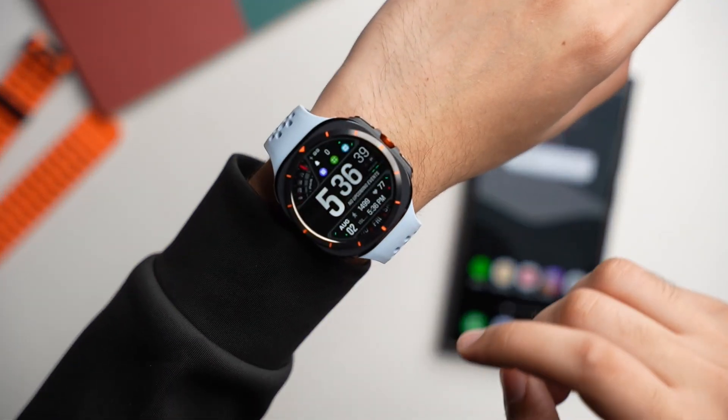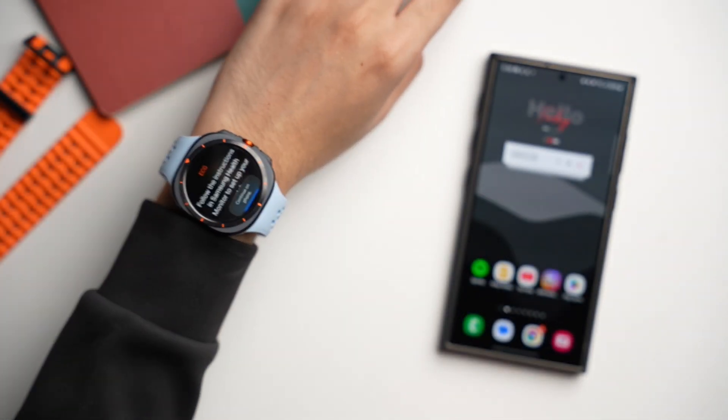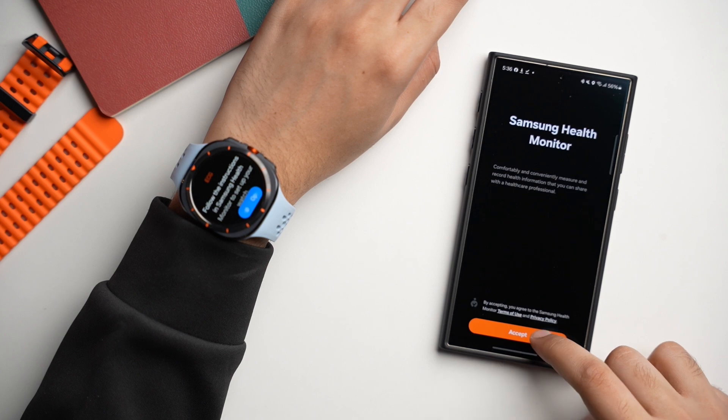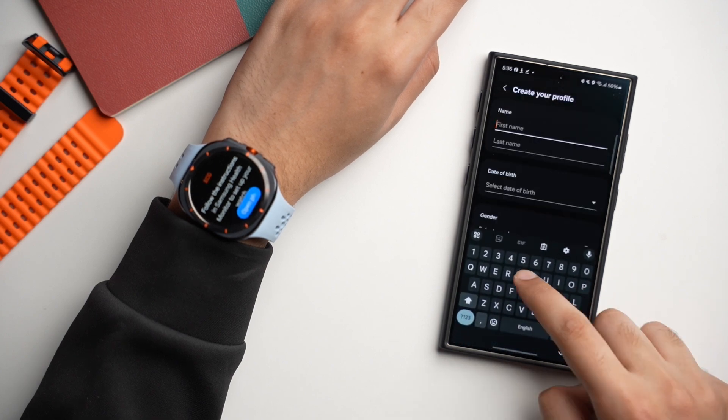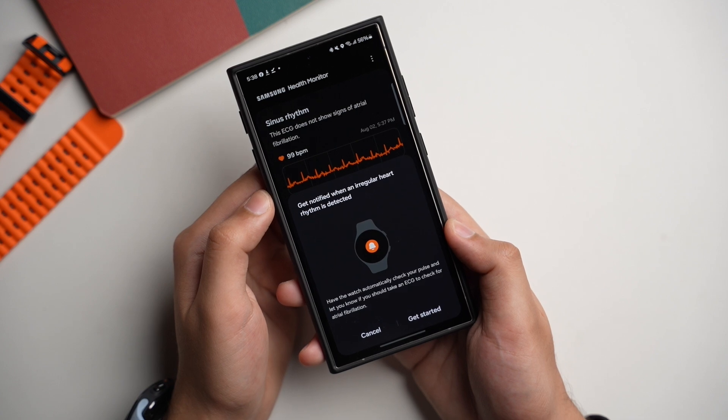In this video I'll tell you how to get BP and ECG on your Galaxy Watch Ultra and Watch 7 if it is not available in your region. The process is pretty simple, so make sure you watch this video till the end. It will also enable irregular heart rhythm notifications on your Galaxy Watch.